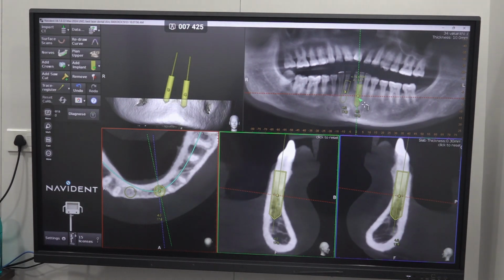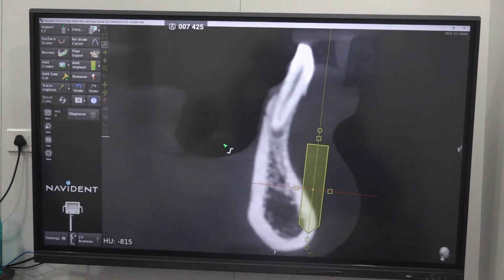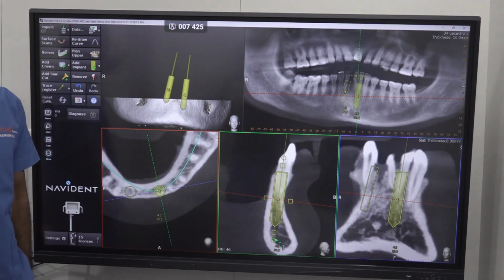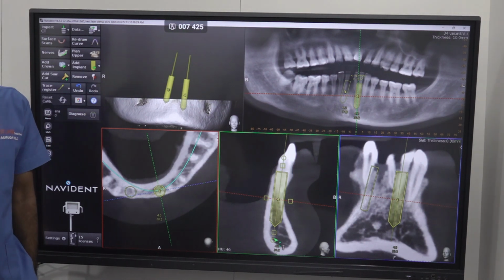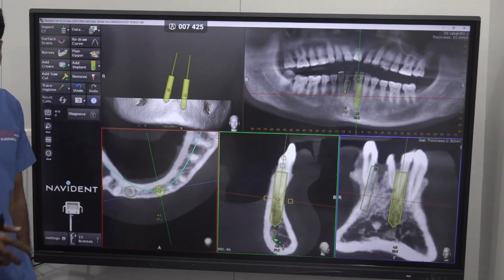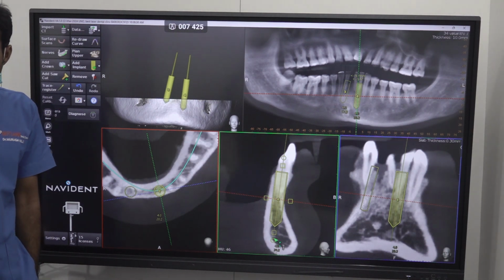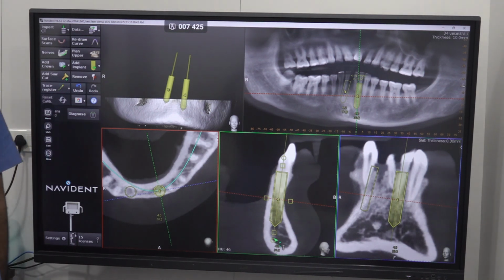You will check, there's a small lesion is there, right? Maybe non-vital or vital. So in the mind, go through the sequence. LA, extraction, curette, check the labial plate also, because during extraction sometimes the bone may come out, and the plan may change at the time. Curette, irrigate, then pilot drilling, select whether compressive or basal. If it is compressive, pilot drilling is enough, no need for further drilling. Select the length and place it.